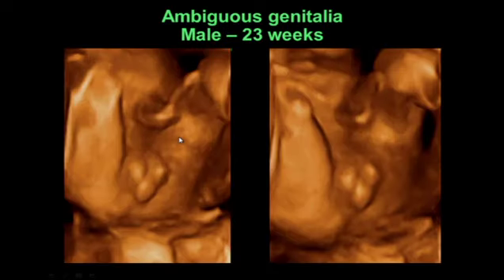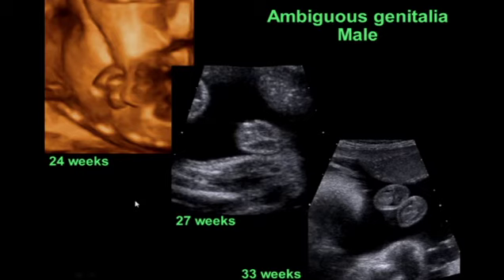Here's a 23-week fetus with ambiguous genitalia. You can see the scrotum here and here is bifid, and that the penis is inferior to the scrotum rather than superior to the scrotum and pointing downward. And here's another male fetus with ambiguous genitalia.